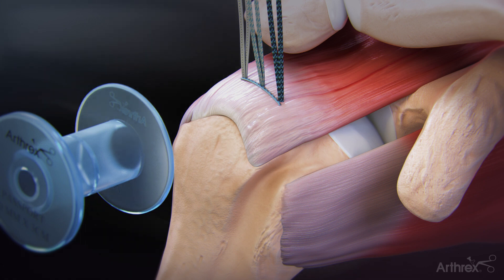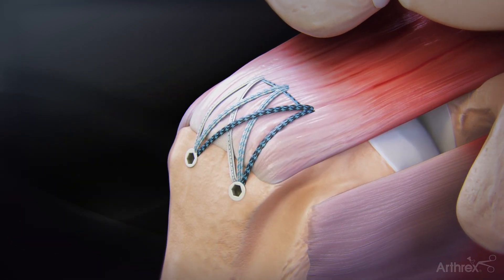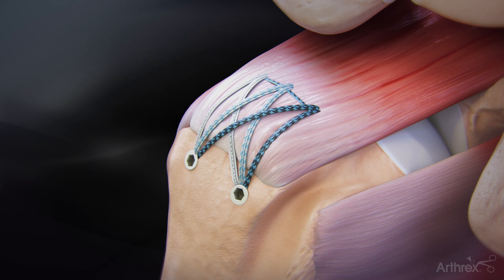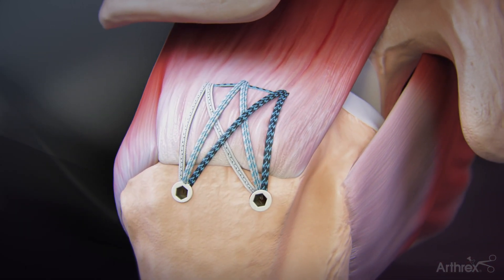Once the medial pulley ripstop is complete, the fiber tapes will be fixated laterally with trusted swivel lock anchors. This will create a ripstop effect between the fiber tapes and medial pulley, helping to distribute forces across the rotator cuff. This completes the fiber tack speed bridge with a medial pulley ripstop.